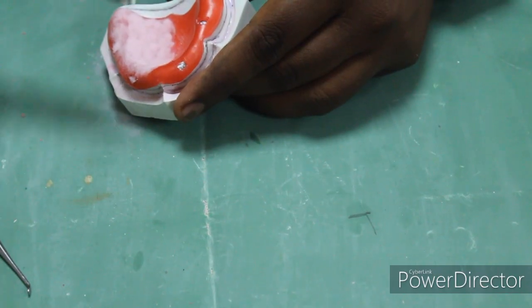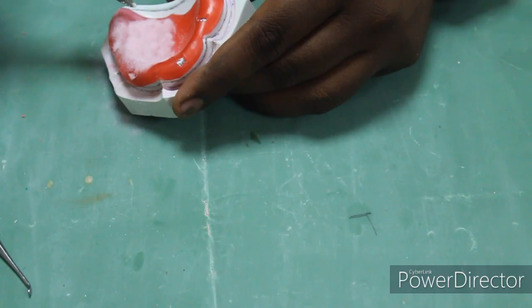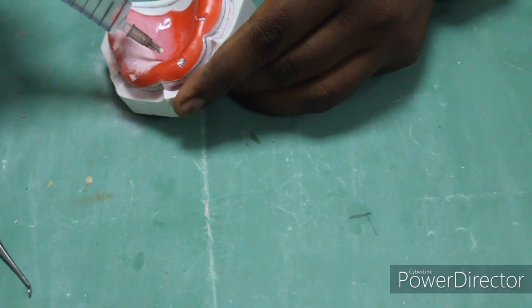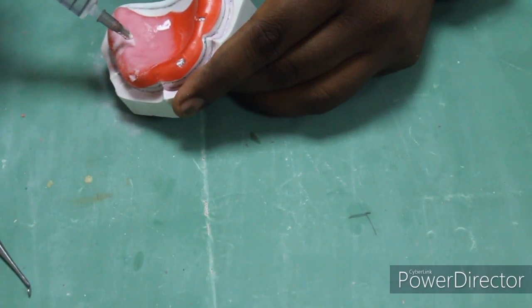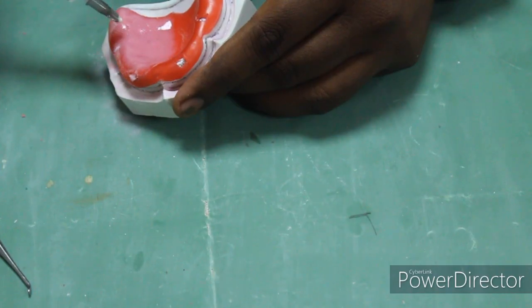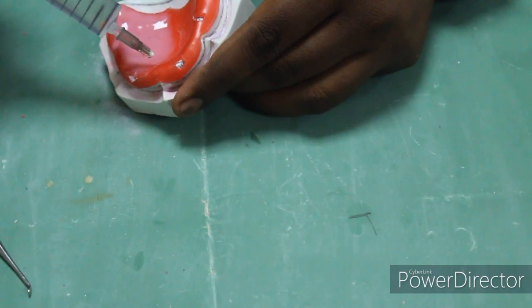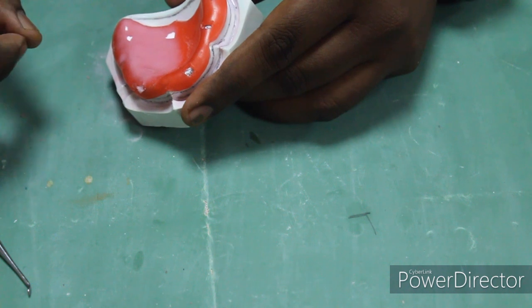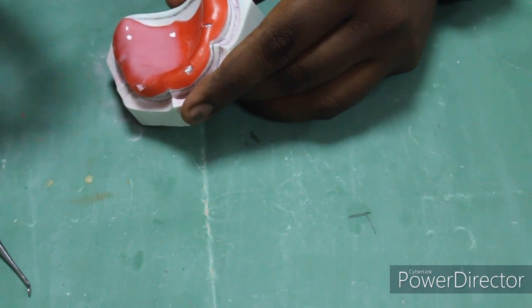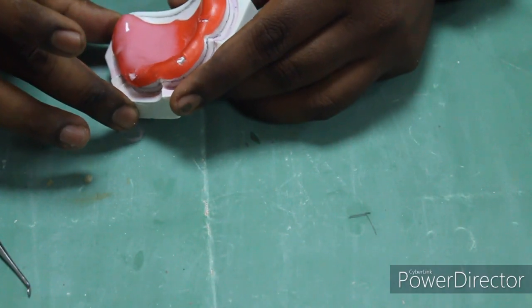So after sprinkling the powder, I am dropping the liquid again. I am still maintaining this portion of the cast in such a way that it should not cause flowing of the acrylic resin from the desired position. So you have to allow a certain amount of time for it to polymerize and to set on the particular location.